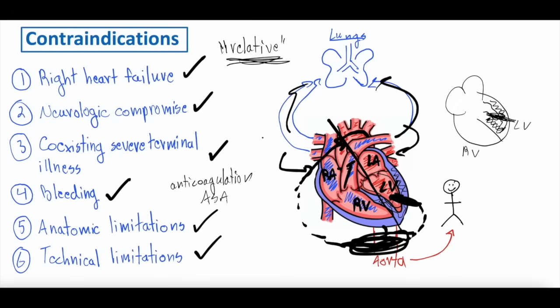All right. The only other thing about anatomy, now that I'm thinking about it, that I didn't say, is remember the heart keeps beating. So not only are you getting flow from the LVAD, so LVAD sucking blood out of the left ventricle, going through the pump into the aorta, shooting that blood into the aorta to go around the body, but the heart is still working. So even if your ejection fraction is only 15%, that means your heart is still able to squeeze 15% of its blood out of the left ventricle into the aorta. So patients get both their native ejection fraction as well as the LVAD flow to help perfuse the body, just if I didn't mention that above.